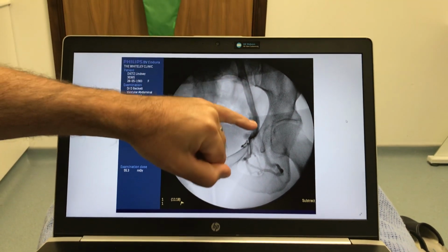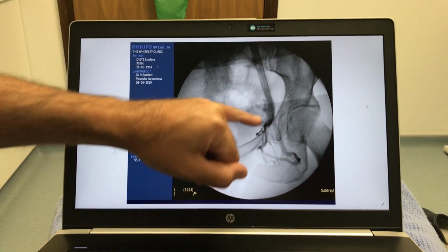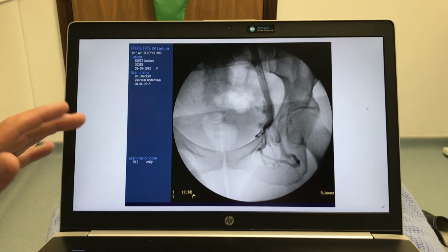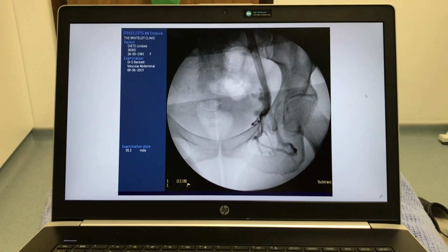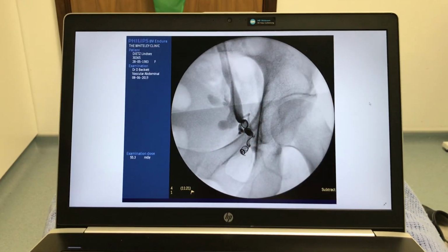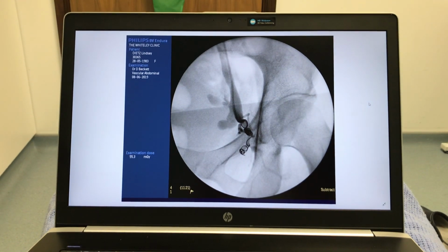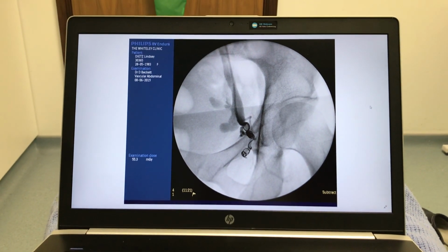You can see the catheter coming down, this little tube, then I've injected dye, and this is the contrast within the vein, okay? So that first one is your obturator vein. And then let's see, perfect. So the next picture is the coil now that's in that obturator vein. So that shows that vein's now been blocked off by the coil.